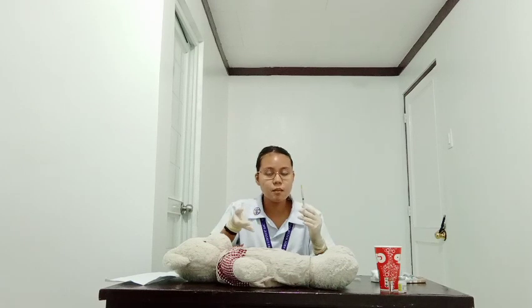Okay, so now we need to grasp the syringe in the dominant hand. My right arm is my dominant hand, close to the hub, holding it between the thumb and the forefinger. Hold the needle almost parallel to the skin surface with the bevel of the needle up, just like this.